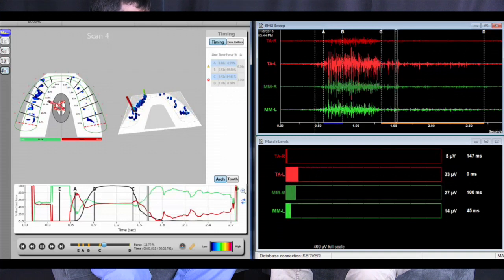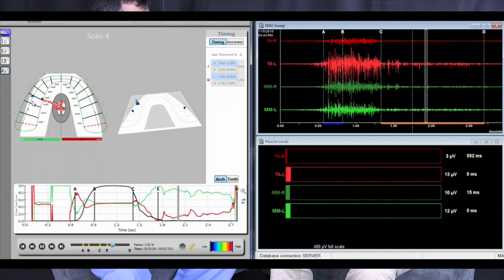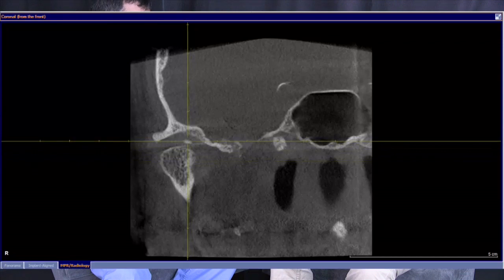Well, it's all related, regardless of what we were taught in school or what we hear in mainstream dentistry. Occlusion and TMD are intricately related. The teeth are kind of a window that we can see on the exterior to give us an idea of what's going on in the interior, being the joints. As far as tools that are absolutely important, the Tscan is probably number one, and I have to image the back. The Tscan, the EMG, the MRI, and the CT, those would be the minimal. I won't practice without it anymore on the TM patient.